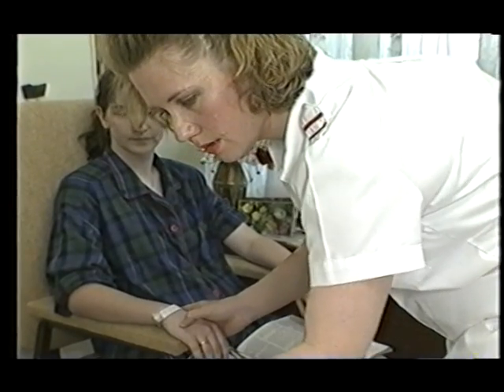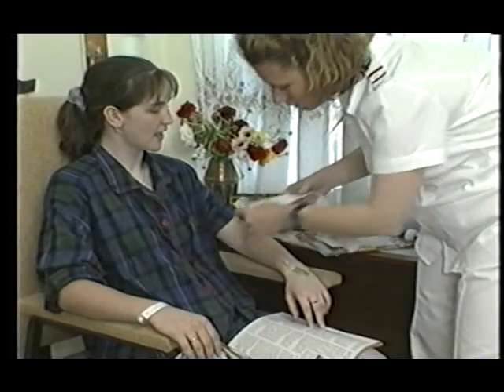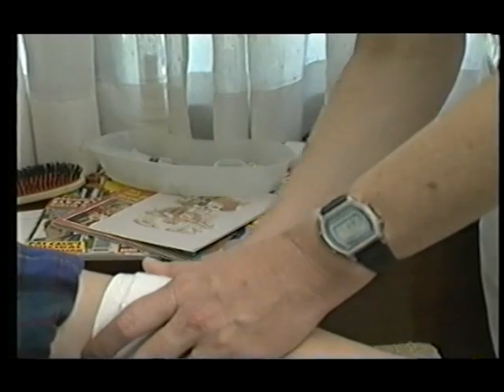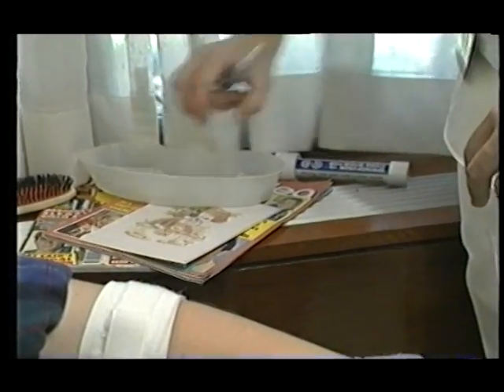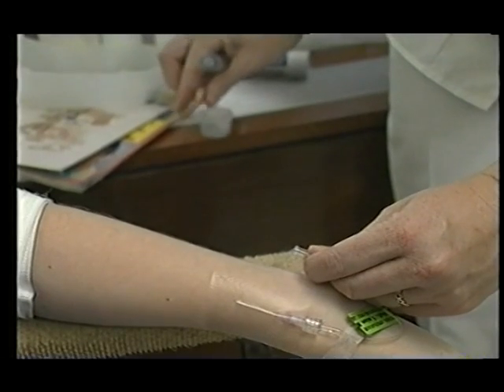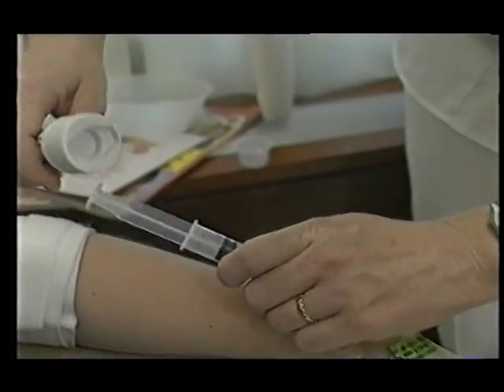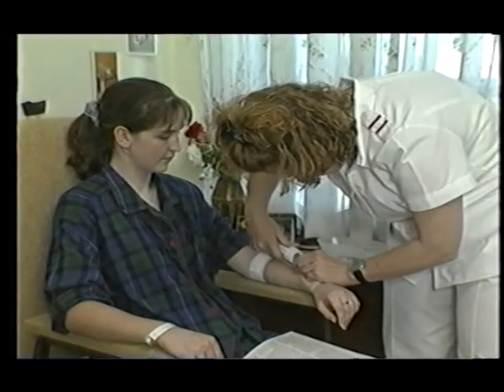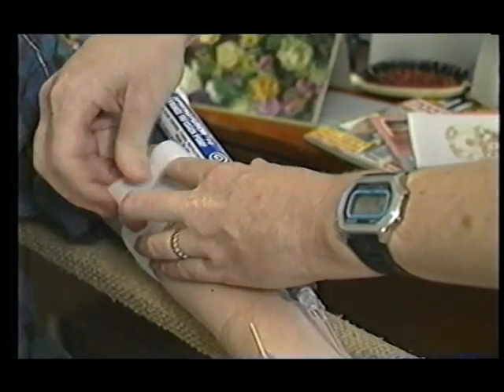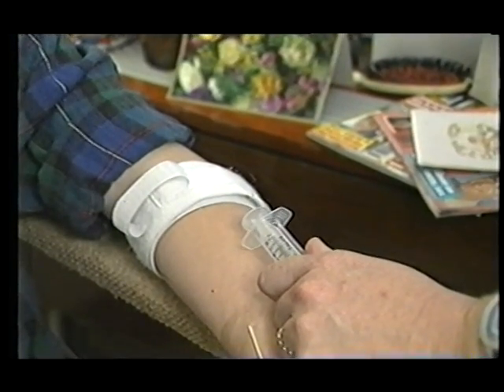This patient is receiving flucloxacillin one gram four times a day. A Spring Fuser is taken to the bedside along with the dissolved antibiotics already drawn into the syringes. The flow control tubing chosen is 10 mils over five minutes in order to replace manual bolus injection. Remove the cap from the flow control tubing and place in a suitable container. Connect the syringe containing the flucloxacillin to the flow control tubing, then push the syringe into the Spring Fuser to start the infusion. You are now free to perform other duties or attend to other patients. When the infusion has finished, simply remove the Spring Fuser and recap the flow control tubing. The tubing can be left in place for as long as standard intravenous tubing.